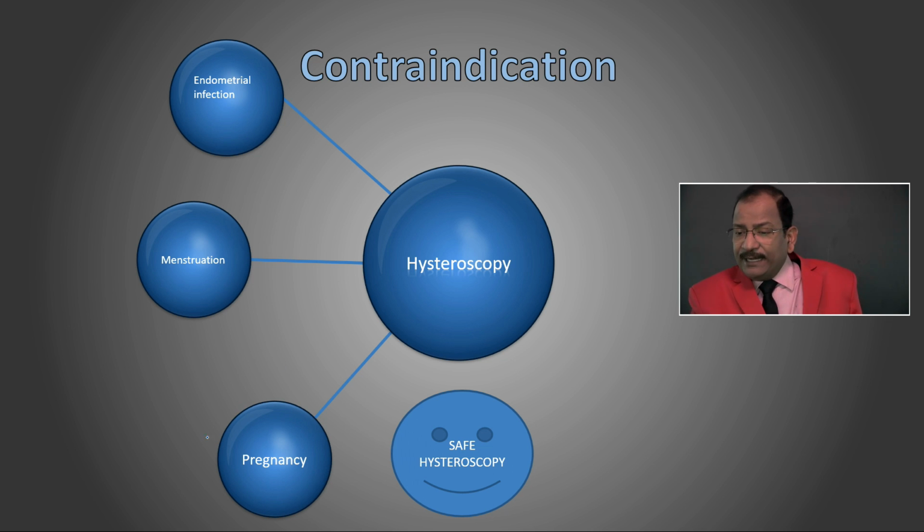Another indication in pregnancy is that in old times people were doing fetoscopy by hysteroscopy. Nowadays fetoscopy is almost obsolete because of 4D ultrasound, MRI and other good non-invasive techniques. Another indication in pregnancy is hydatidiform mole together with a continued pregnancy, but it is rare.